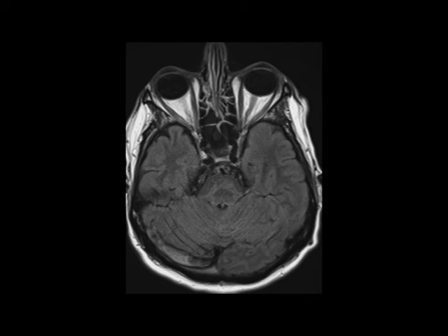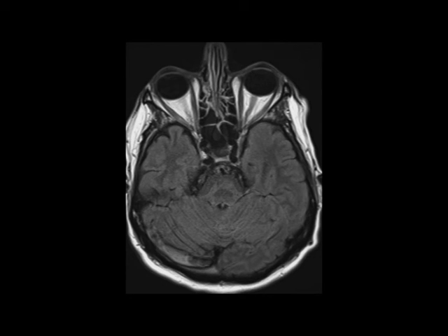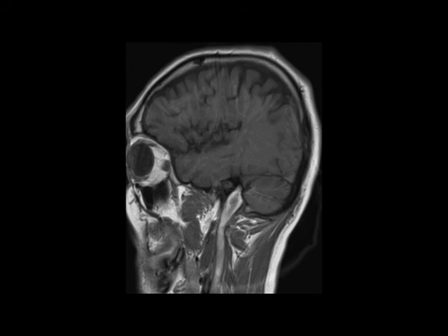As we can see on the left, the normal appearance of the dural venous sinuses is hypointense on the T2-weighted sequence due to the presence of venous flow.